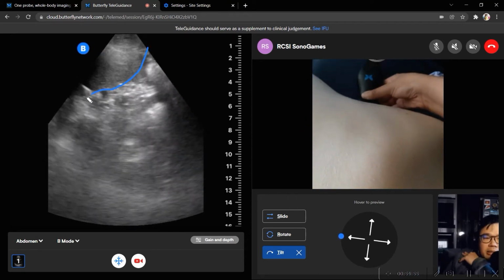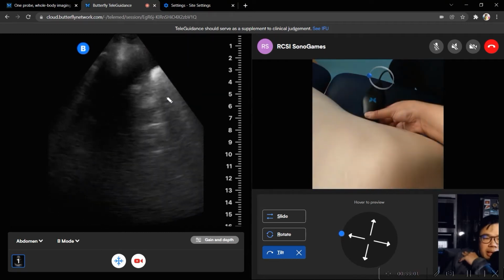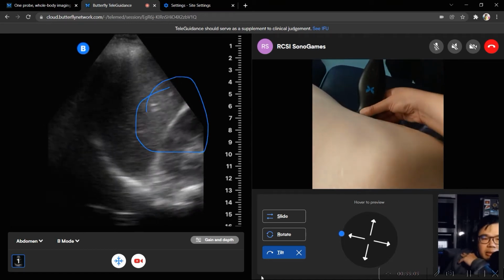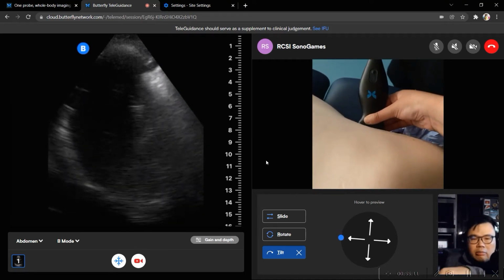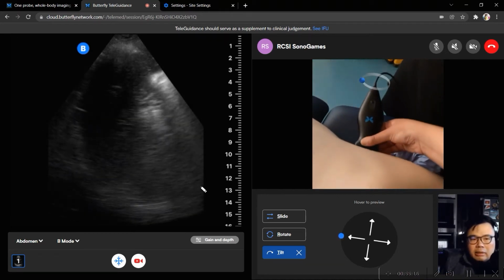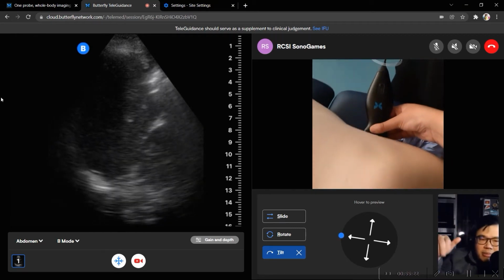So you see spleen here? Yeah. Okay. Now, if you tilt the probe tail up a slight bit, you should start to see the kidney over here. There you go. Oh yeah. Okay. So if you had the probe completely tailed down, what you were seeing was bowel, likely stomach. Yeah. Okay.